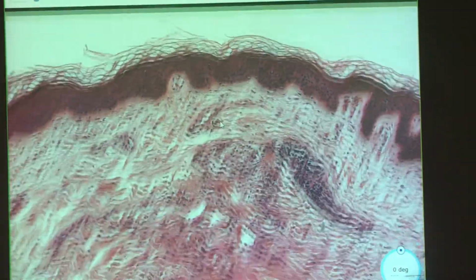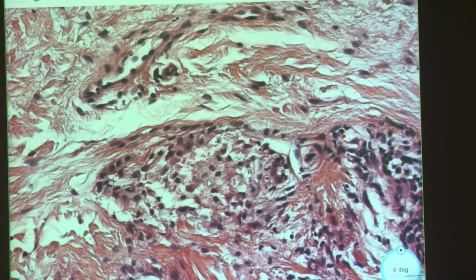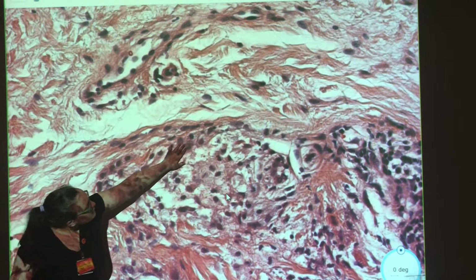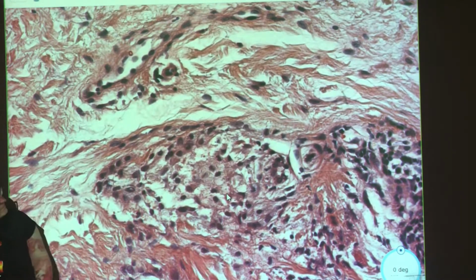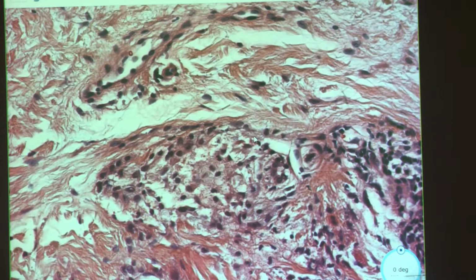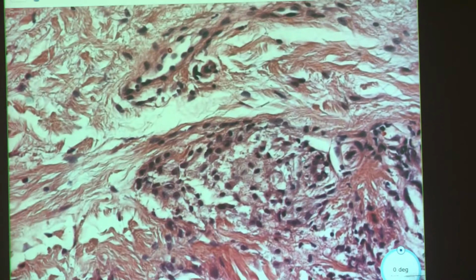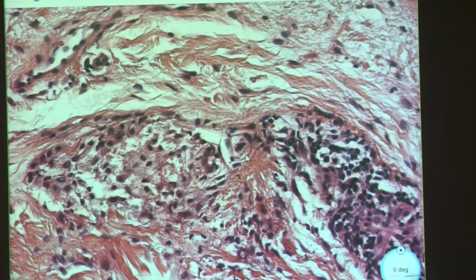Do they all look foamy? Not all of them, but just maybe. Yeah, because maybe some of the ones up here are not as foamy looking. Like, whereas these guys are definitely foamy. So there's some macrophages, and they're definitely macrophages, but it's not as foamy.